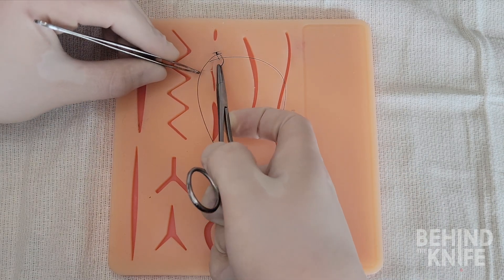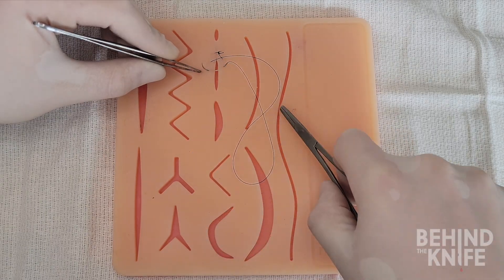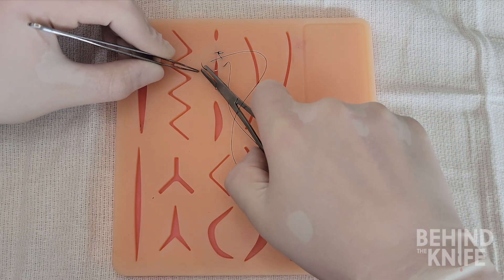We will repeat this again. Needle comes out of the epidermis, needle drivers comes through the loop, and then grasp the needle and pull it laterally.